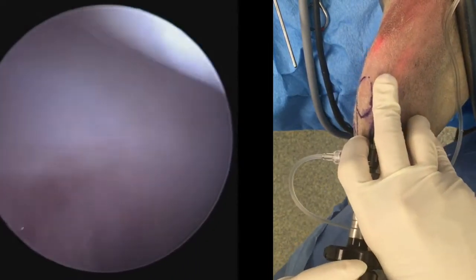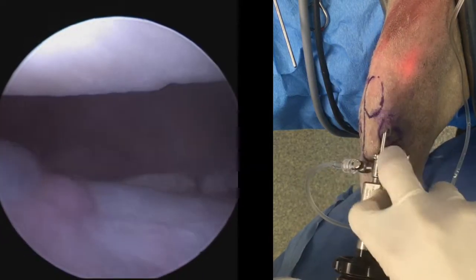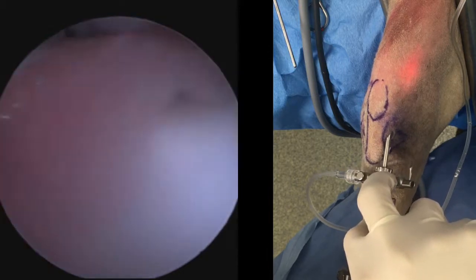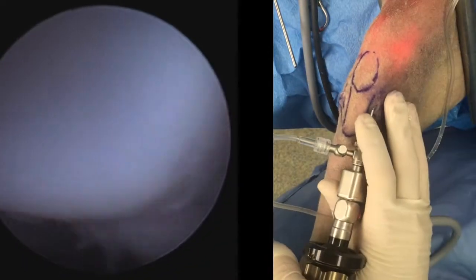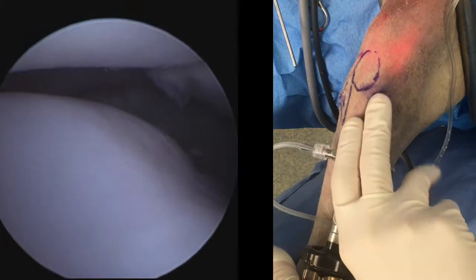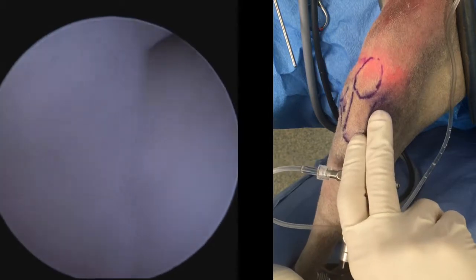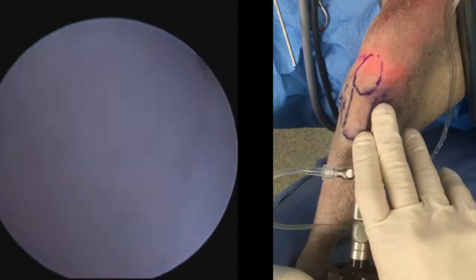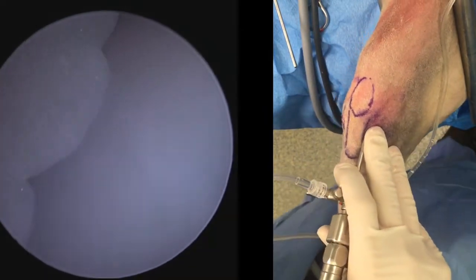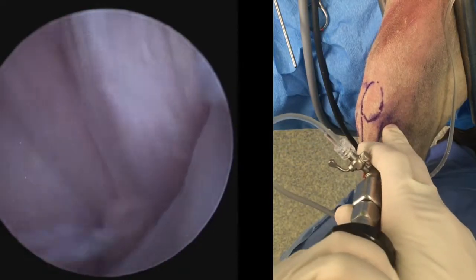Continuing up proximally, the arthroscope can be lifted into the patellofemoral joint. At the bottom of the screen we have the trochlea groove, and at the top of the screen we see the articular surface of the patella. As we raise our hand, we're now starting to look down to the joint line of the stifle, until we finally fall back onto the intercondylar notch.